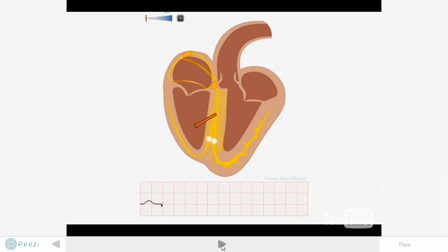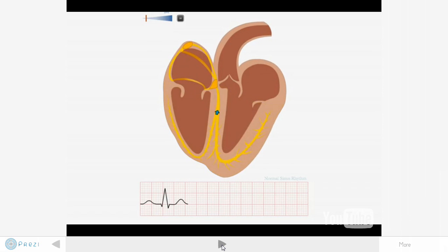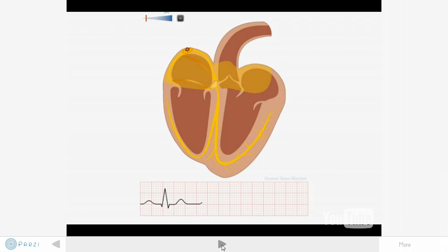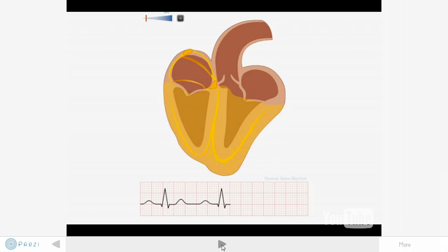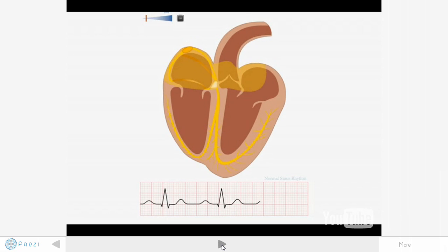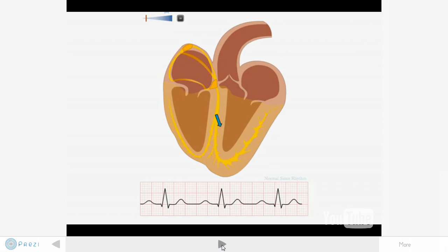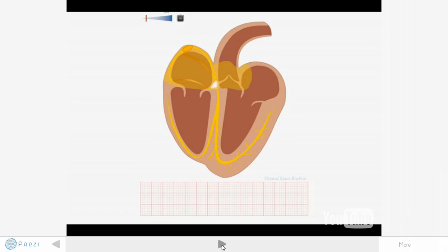The ECG trace shown here belongs to the V6 lead. Since the left side of the heart has more muscle mass, the net direction of depolarization and repolarization are both to the left. When directed towards the electrode, depolarization is seen as a positive deflection, and repolarization corresponds to a negative deflection. The P wave represents the atrial depolarization.